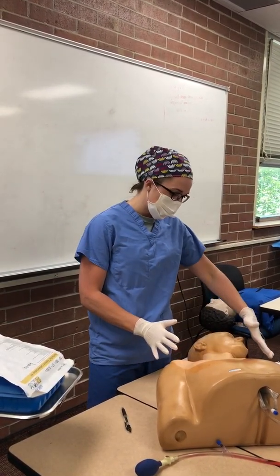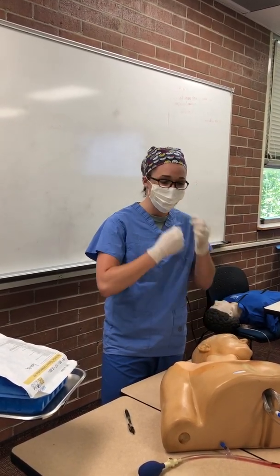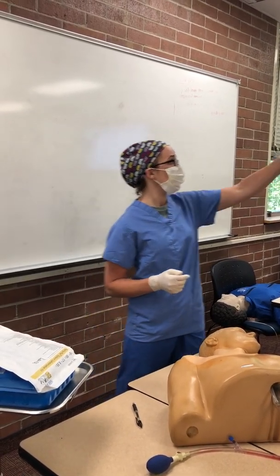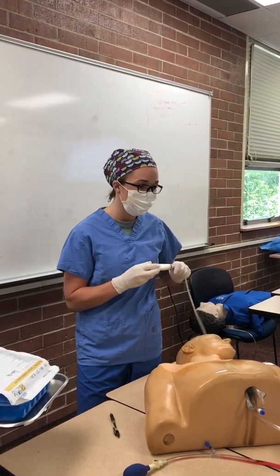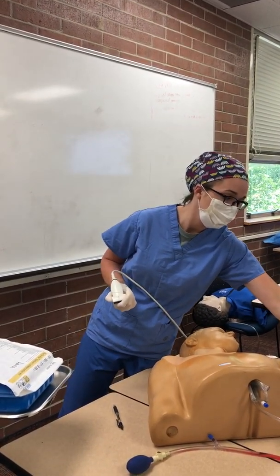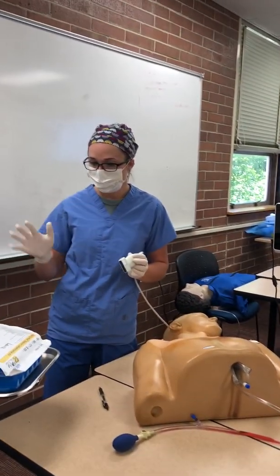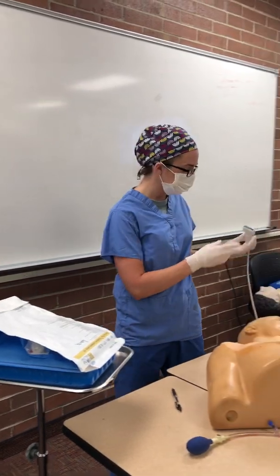He'll be supine with his head turned to the left. He could potentially have his head up a little bit, depending on what I needed to visualize. So first off, I'm going to take a look with my ultrasound. I'm going to be using an ultrasound and a nerve stimulator. And then I already have all of my other equipment ready in the room.